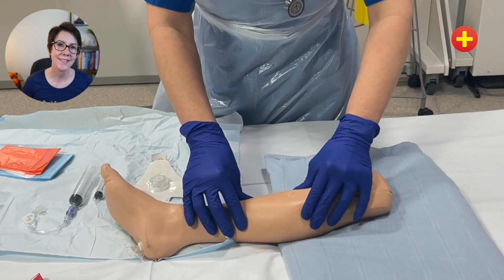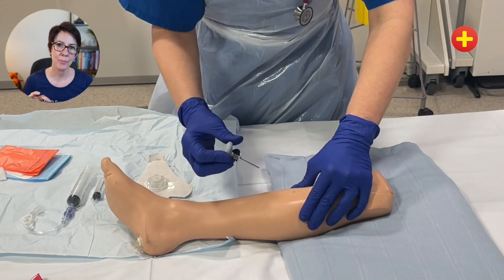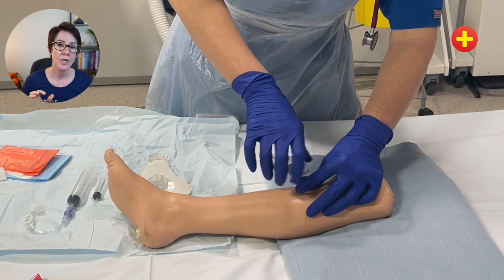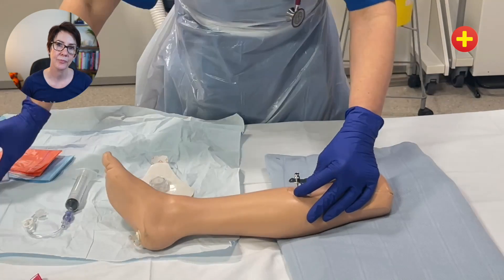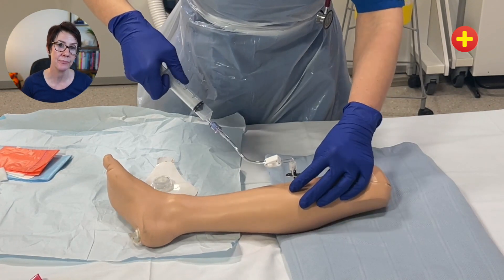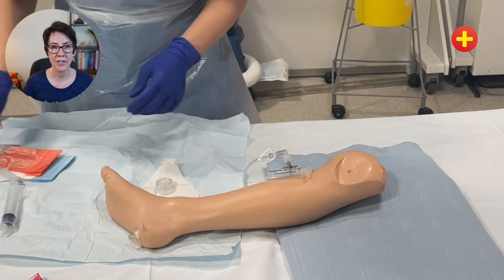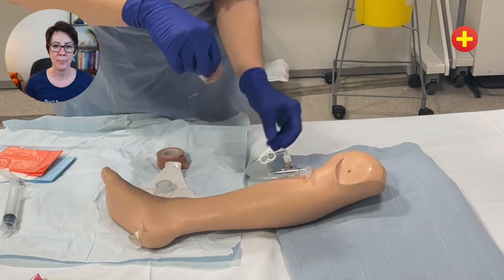We'll have a look at the manual technique as well, as it is still used occasionally. The key point with this technique is to hold the needle near the tip rather than on the plastic head, so you've got better control. Get through the skin, rest on the bone, and use a firm twisting motion just until you feel a give. Remove the needle and it should stand firm without support — you can aspirate at that point. Then attach the extension set and give a good firm flush; remember the pressure is going to be high at that point. The real challenge with manual needles is getting them secure because they don't come with their own dressing. I tend to use the barrel of two syringes, one either side of the needle, and just tape across them — that stops the needle wobbling and protects it in the busy resus room.